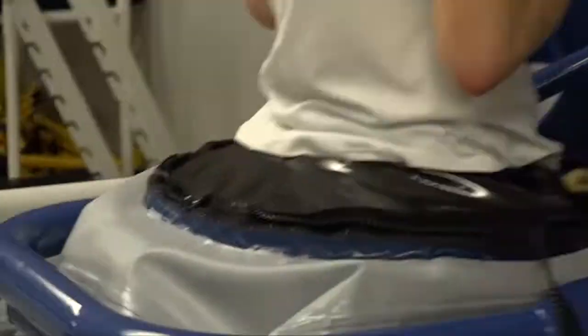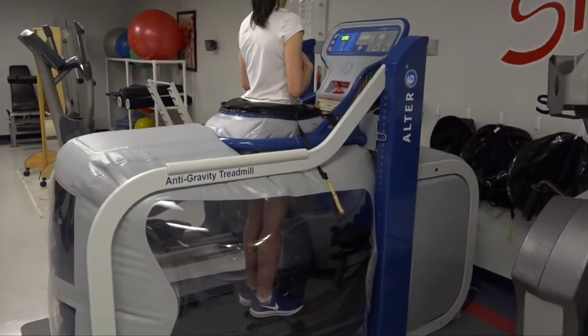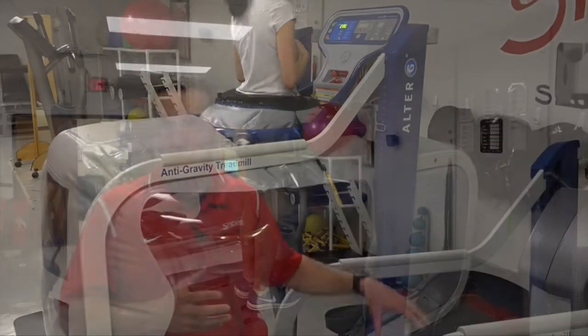First, it calibrates them. So if they weigh 200 pounds, it's going to calibrate them as 200 pounds, and it can make them feel as light as 40 pounds or stay at 200 pounds. It does that by changing the air pressure, basically lifting them off the ground to change how weight-bearing they are. It's pretty good technology.